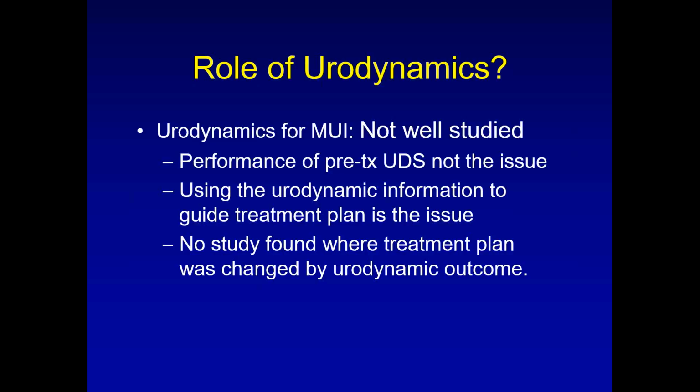So it's not the performing, it's really how you're going to use the data to guide you, and hopefully with the case presentations we'll get there. I can't tell you that urodynamics really makes a difference in the treatment plan. What I mean by that is if you're looking at urodynamics to tell you that one treatment is better than another, it's not going to do that. A rare exception with anecdotal stuff, we'll go over it in a minute. But for the most part, if you think you see stress incontinence in a mixed incontinence picture, you're going to be treating the stress however you would normally treat the stress. We'll go over that now.